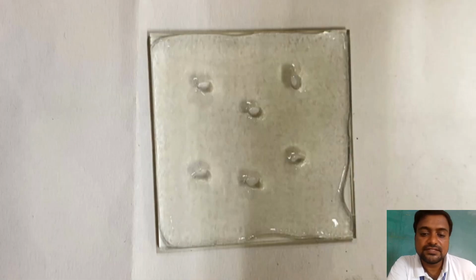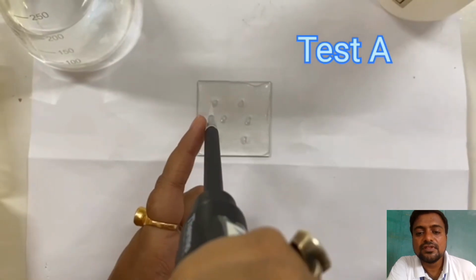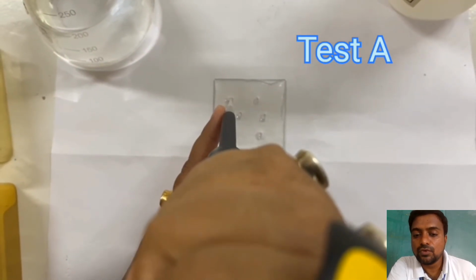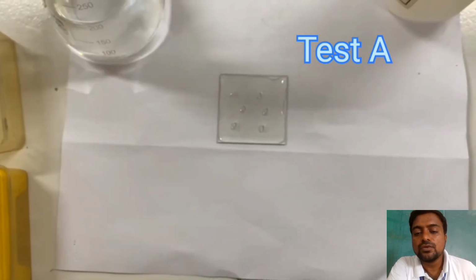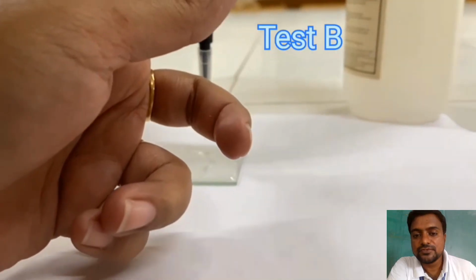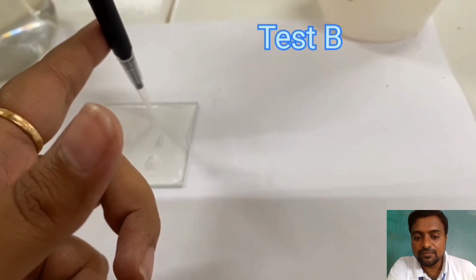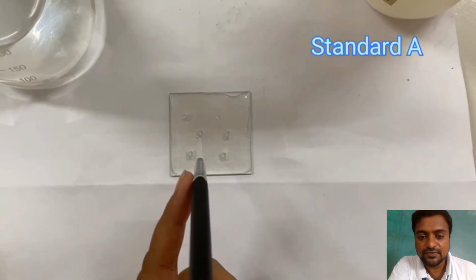Now you can see there is a clear formation of wells. Let's take test A and add it to one of the wells. Likewise, all the wells will be loaded with different types of antigens of different concentrations, depending upon the experiment we are going to perform.